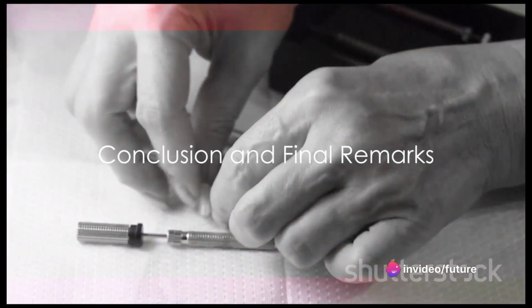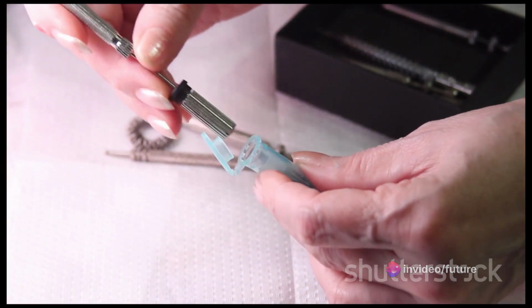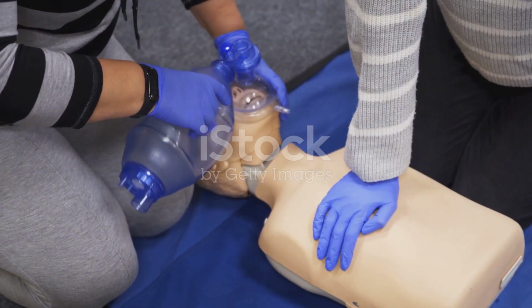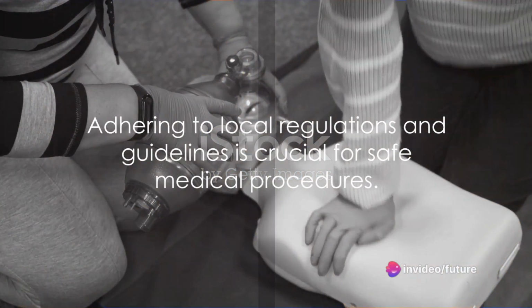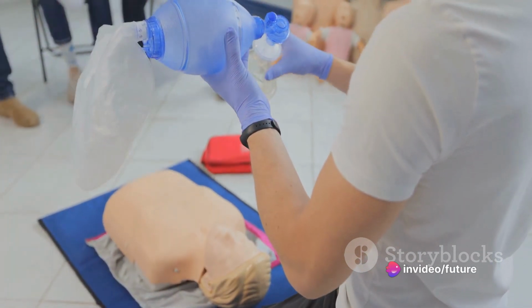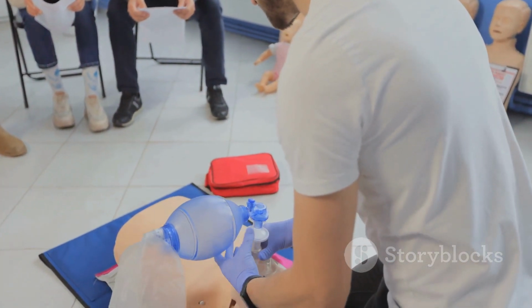And there it is. You've successfully navigated the process of intraosseous cannulation. But remember, practice is key. Keep refining your skills through simulation training and real-world scenarios. And as always, adhere to your local regulations and guidelines when performing medical procedures, and seek appropriate training and supervision before attempting any new technique.